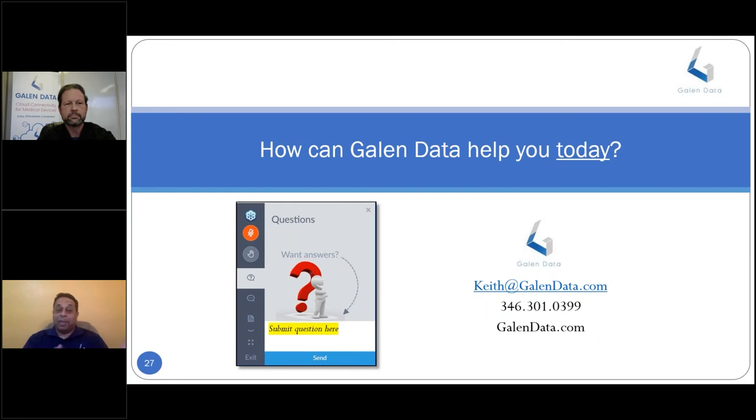So you want to do it as early as possible because any new thing, even if you're going to use an existing system, there is something new about it. And there's always issues with that, but you want to mitigate upfront and not wait till the end. Secondly, having connectivity also can help with your early evaluation, specifically if you're doing small scale studies or even large clinical studies. You can collect data easily instead of having your CROs manually collect data and transcribe it and capture it that way. So it helps you in a lot of ways, can be more efficient right away. And a connected solution ultimately needs to be tested. So if you build it early, you can test it very well. And when you go to market, you have confidence that this system is going to work well.